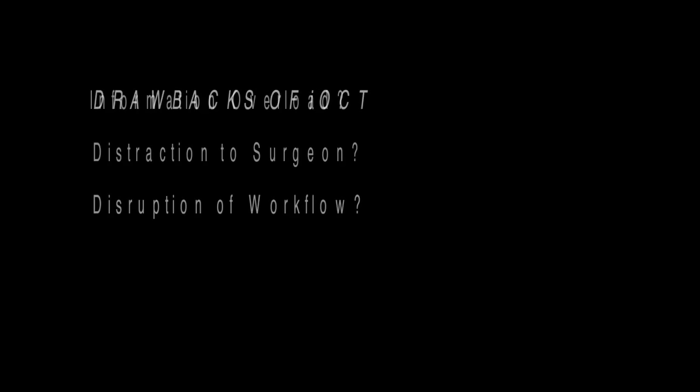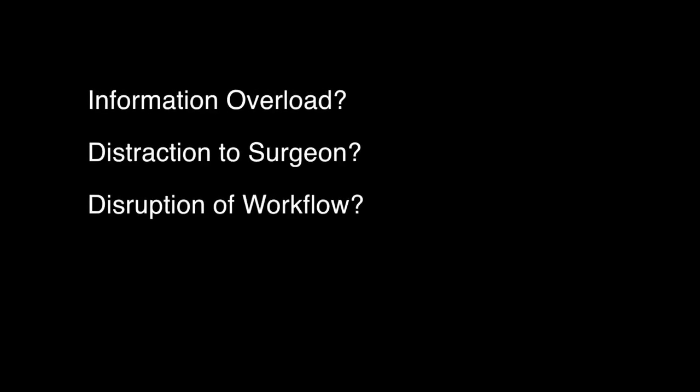While intraoperative OCT is fast gaining momentum, a few drawbacks are hard to ignore. Presence of additional OCT information in the microscope oculars may cause a distraction to the surgeon and cause disruption of normal workflow. Also, with any new technology, it's hard to ignore the cost. Research into instrument materials that do not cast shadows is also underway.